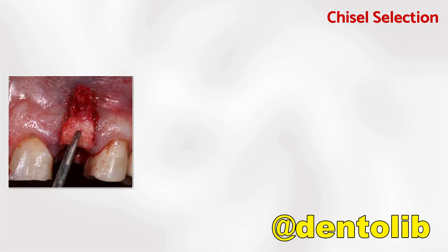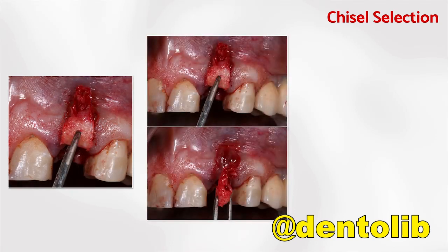Another example. Here we have already performed, in the outer portion of soft tissue, the drawing of the defect using blood from the socket. This is the extension and the configuration of the defect. And we superimpose the graft as soon as we harvest it from the maxillary tuberosity. We have to pay attention in this graft, the width, the length, and the thickness should be coincident with the gap width.